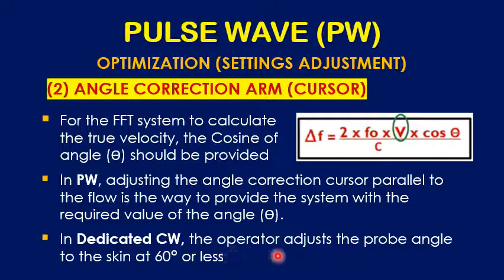depends on my adjustment of the probe to the skin, so that I can put the probe in a 60-degree angle to the skin, so that it can calculate as accurate the velocity range.